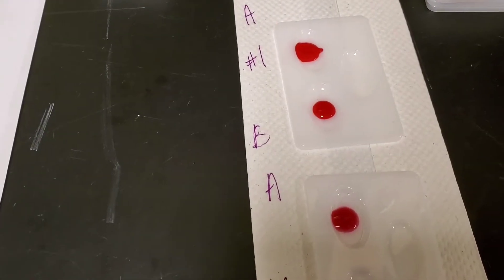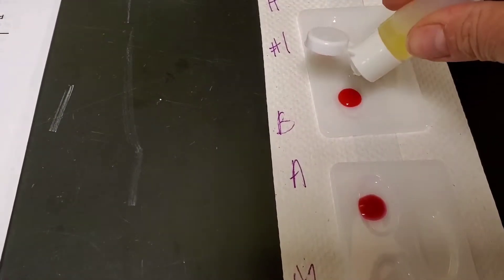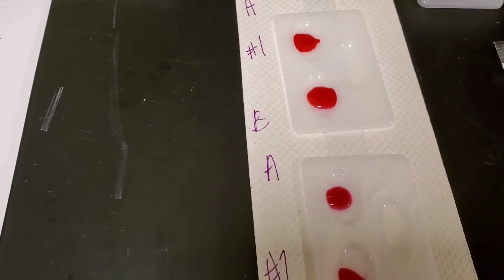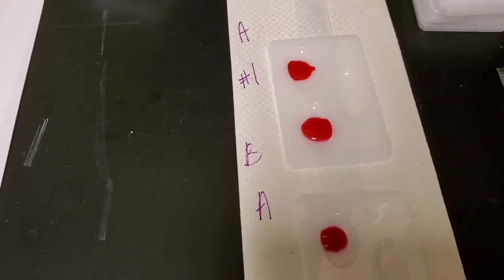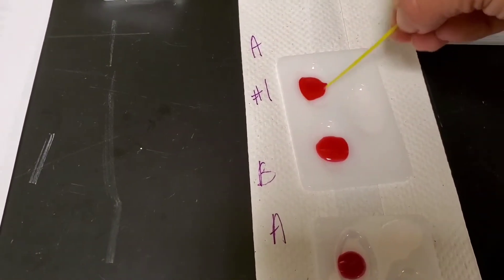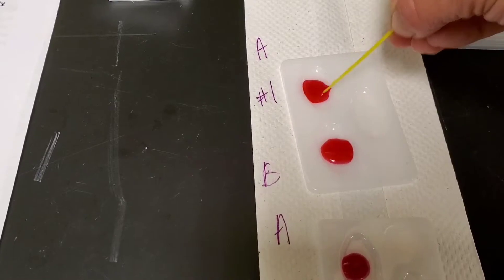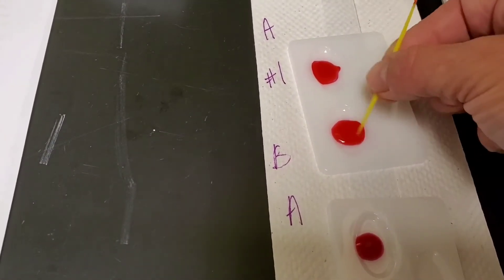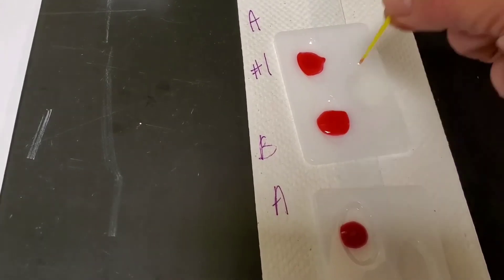Now I'll take a little q-tip and mix it all around. I'm going to flip my q-tip over so I don't put one kind of blood in with another.